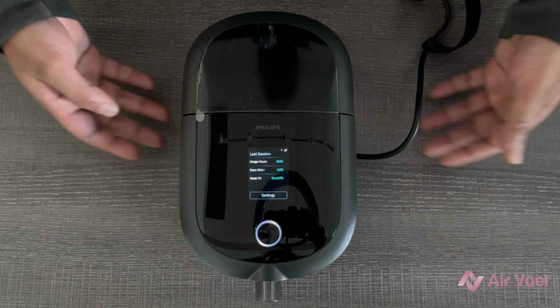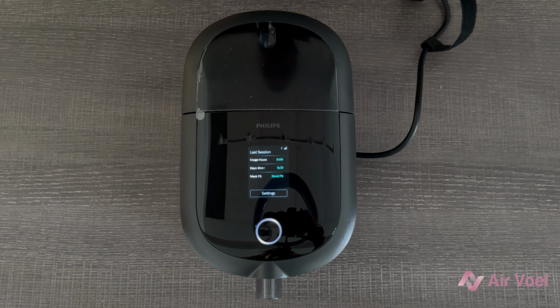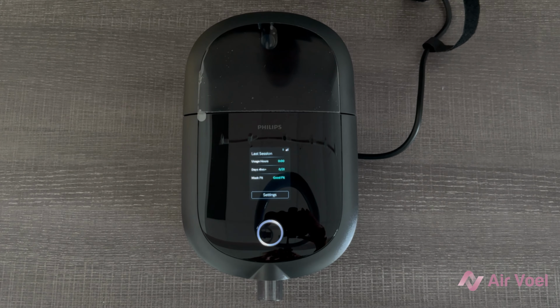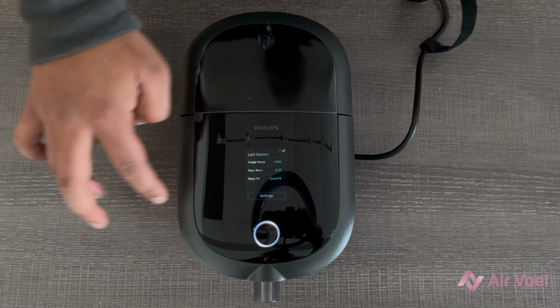Okay, so first step, you want to make sure your device is plugged in, receiving power, and you're on the home page. You'll know you're on the home page because you should see your last session message, which will give you some information on your previous usage, and then you should see settings display on the screen as well.